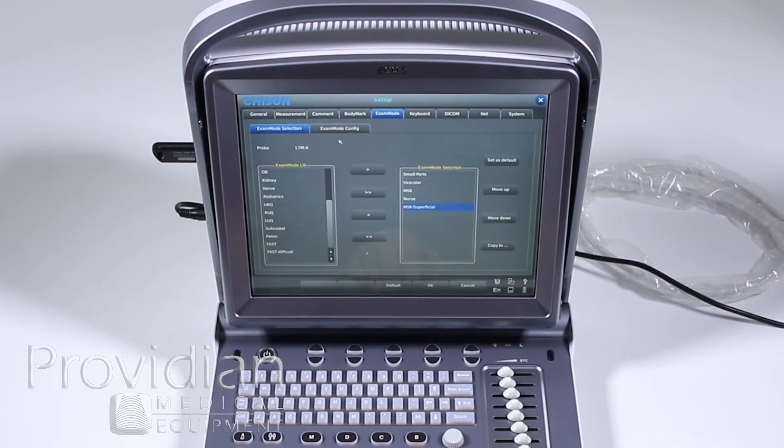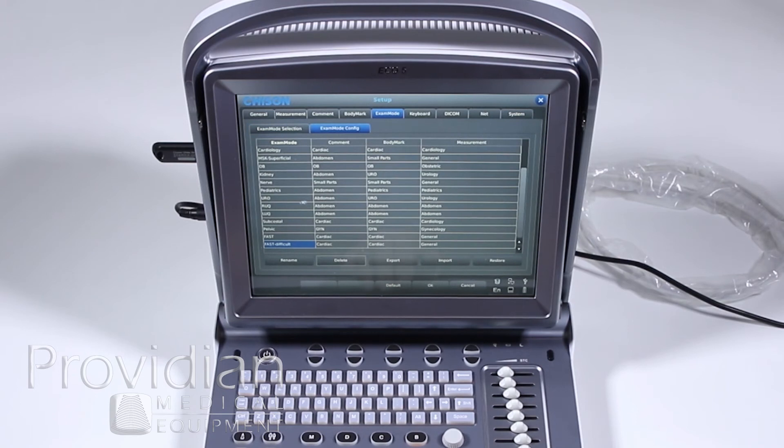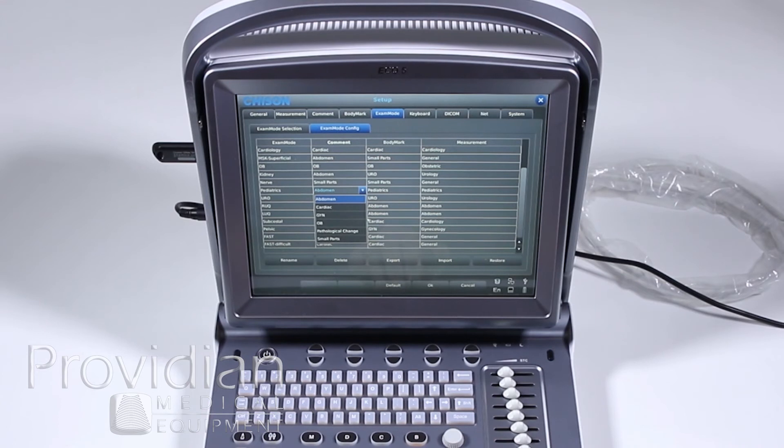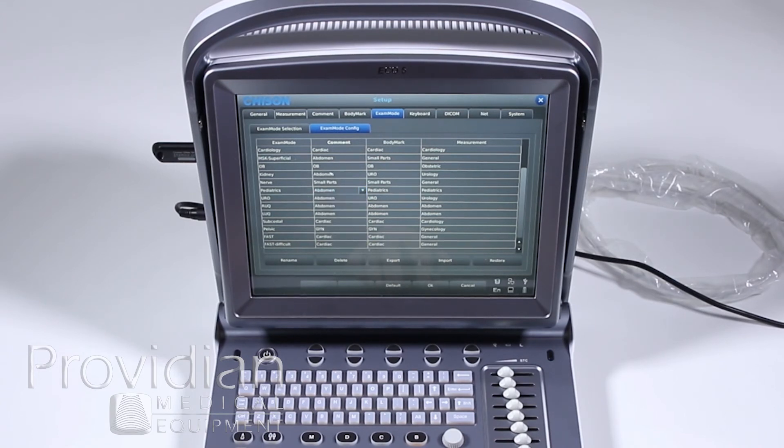And over here, for this configuration for the exam modes, say in pediatrics you want different libraries show up for comments, you can double click on it and select, say you want the small parts library in pediatrics or something of that sort, depending on what it is that you're looking at. So again, all this is very, very customizable.